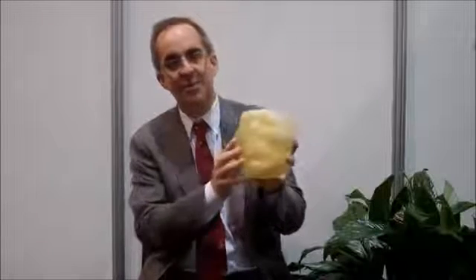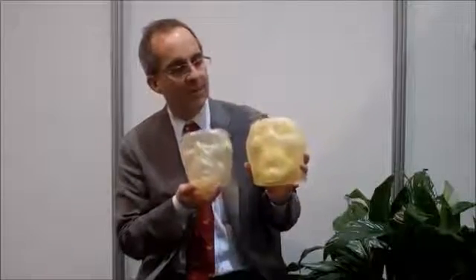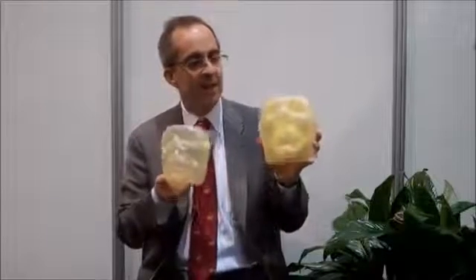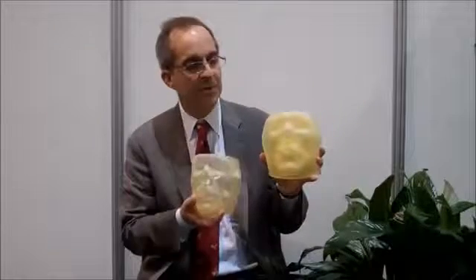And it's very likely that they correspond to other factors in terms of the face transplant science. How the soft tissues are remodeling. Is the volume somehow related to rejection as it changes over time? And so we have here only two points in time of Carmen's state, before the surgery and a recent CT scan. But you can imagine in different patients we could get several points in time and start to understand the biology of what happens after face transplantation.